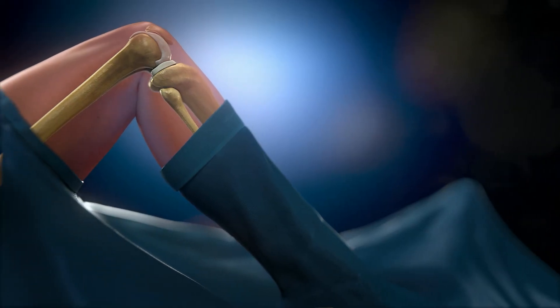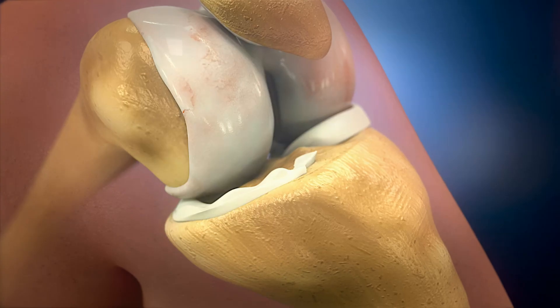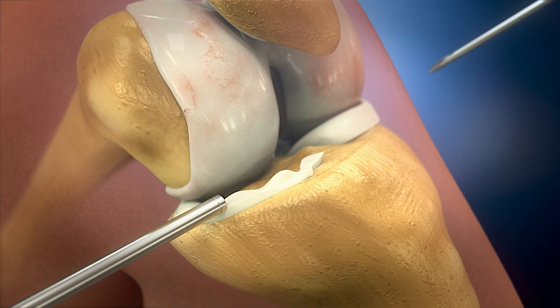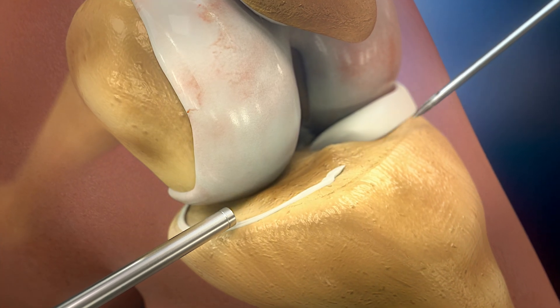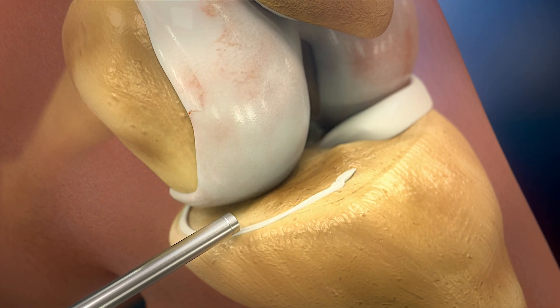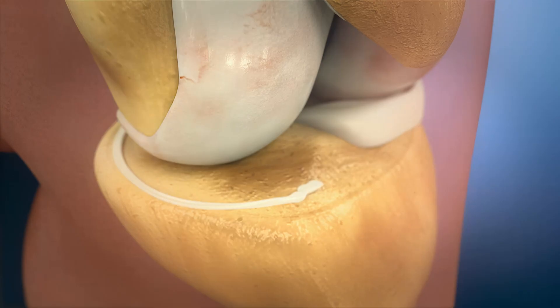Before the procedure starts, the flexion and extension of the knee joint is evaluated. The procedure starts with trimming the damaged meniscus. It is not necessary to have a remaining rim of the meniscus. Important is to remove the remnants of the anterior horn of the meniscus and also to remove part of the medial infrapatellar fat pad for visualization.